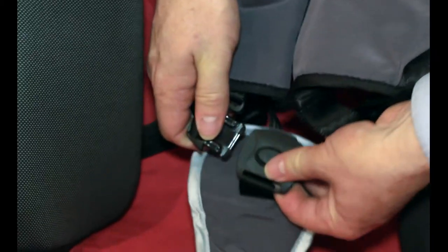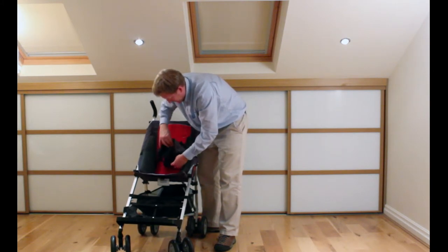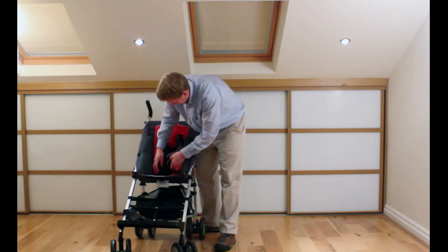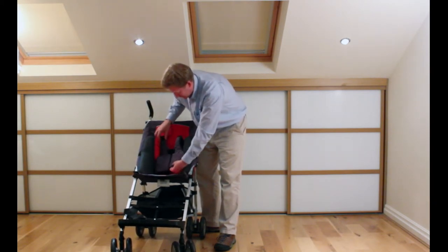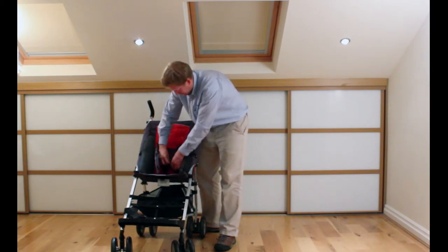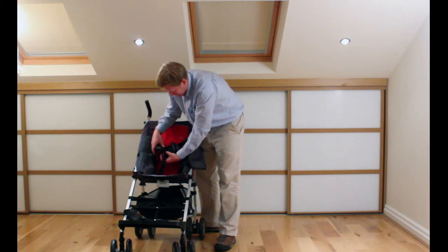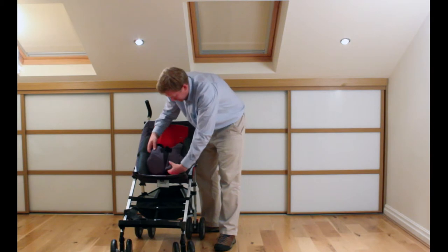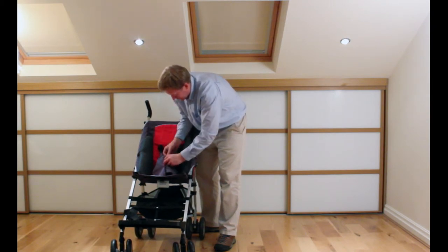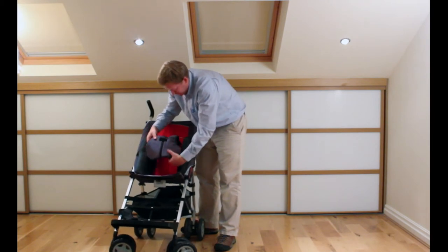You just slide it, put the loop through, and then connect it back up and click it in place. You've then got two armrests and you can adjust them to the right tension on each side — particularly the top, to hold it in position. To get them in and out, just unzip. You can use one or both as needed for extra security. There's a zip to close it back up, and then a little velcro tab to try and stop them undoing the zip, so they won't get out.